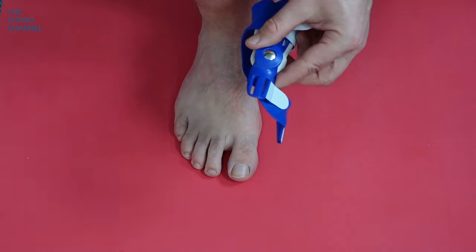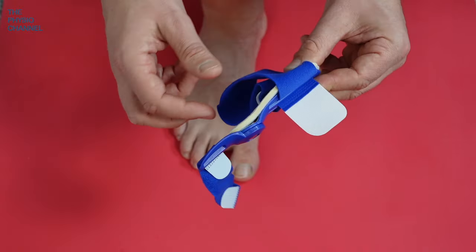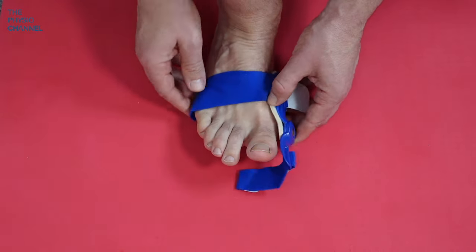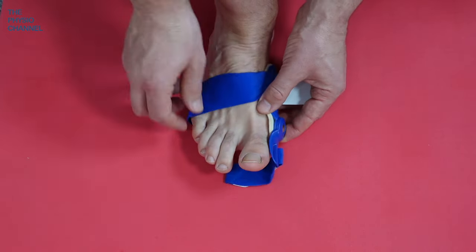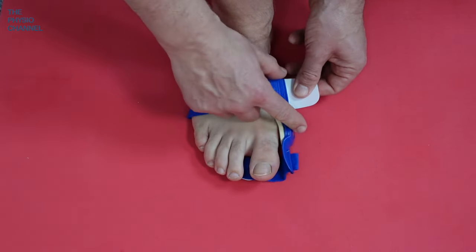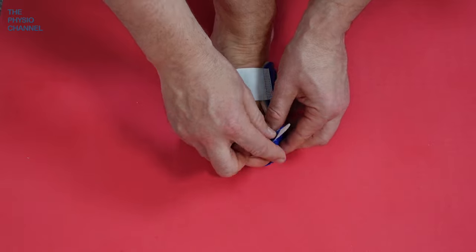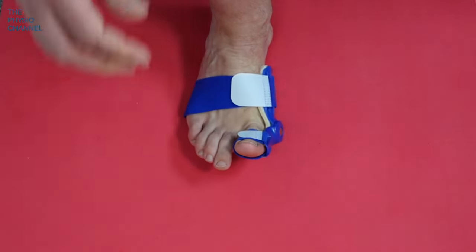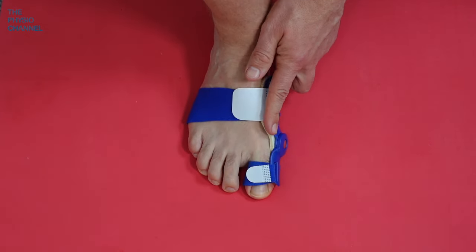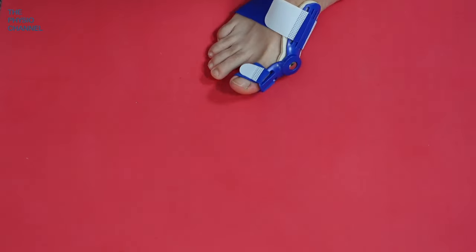Next we're going to fit a dynamic splint. Although rigid, this splint has a hinge that allows the toe to bend. Slide it over the foot, get the hinge in place just to the lateral side of the ball of the foot, pull the strap and stick it down — that's velcro and easy to do — then bring this one around the toe and thread it through. That's the dynamic splint, and it feels pretty comfortable with a foam insert.